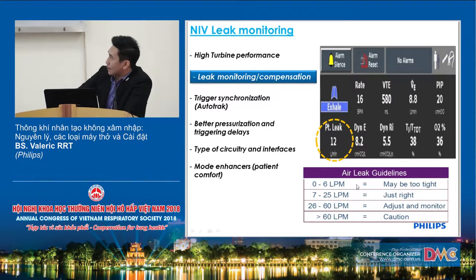And more than 60, maybe it's too loose, so you have to reposition your mask again. So you have your reference here, or guide, for you to be able to know if you rightly positioned the mask or not.